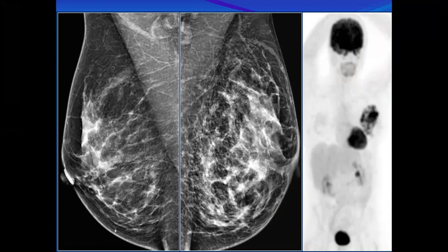But you might see a global asymmetry associated with an enlarged ipsilateral breast, and in other patients global asymmetry associated with a smaller breast. Which one is suspicious? The enlarged one. Why did you confidently say the enlarged one? This means it's not a normal variant. There is additional pathology. And if the global asymmetry is smaller compared to the other side, it will be a variant. Why is it small?